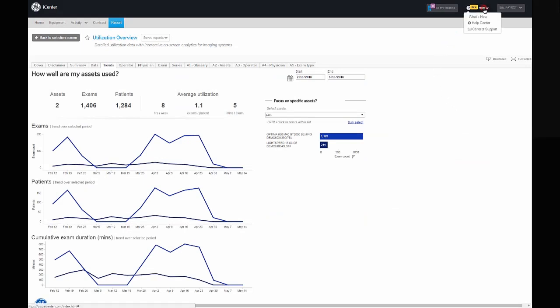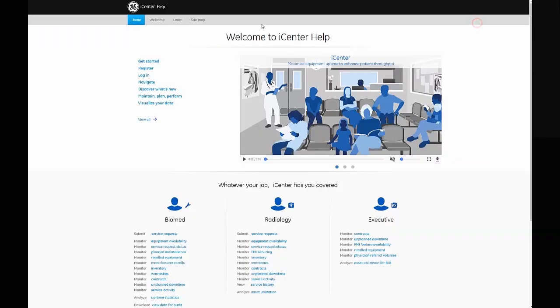In case you need assistance, you can contact support or access the online iCenter help center.